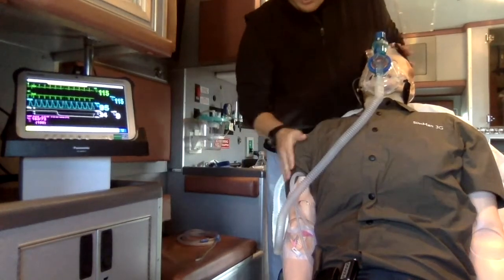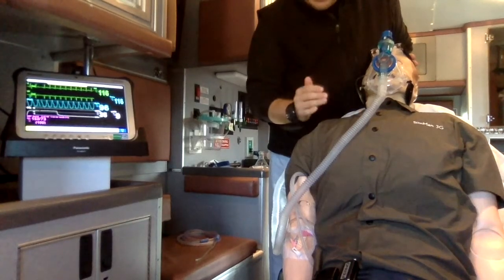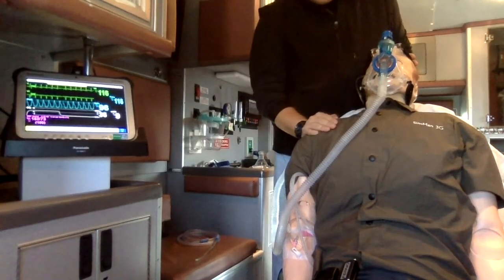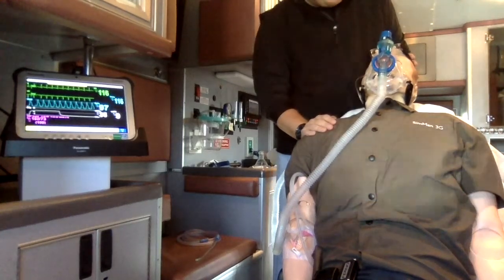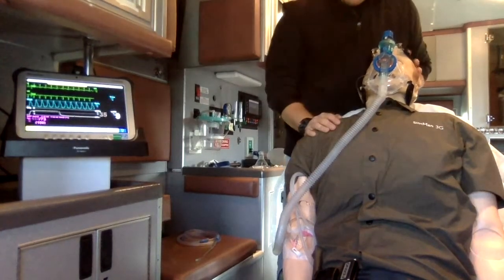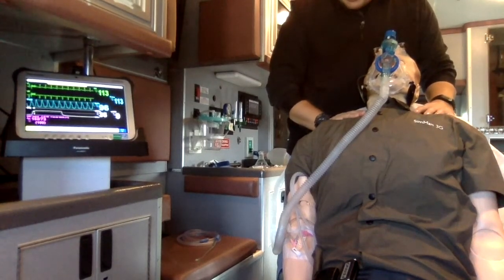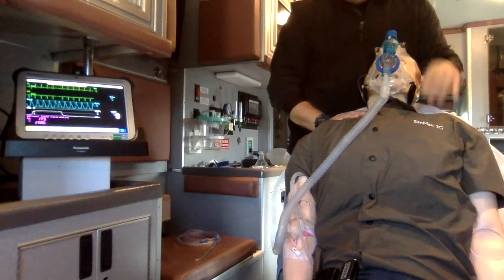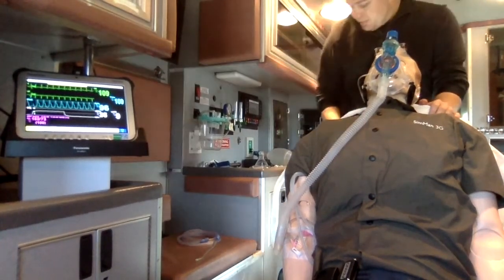We're going to push our paralytics. Should have the desired response. For this scenario, I chose rocuronium and etomidate, both weight-based and appropriate doses. I get the desired effect. He is chemically paralyzed and no longer has a respiratory drive, so we're providing that for him with the vent circuit that's applied. Everything's prepared and set up.